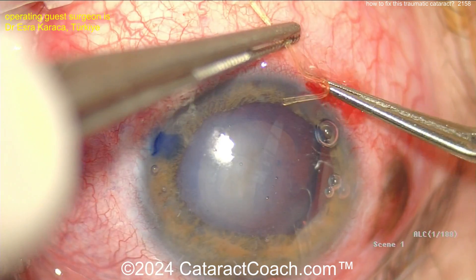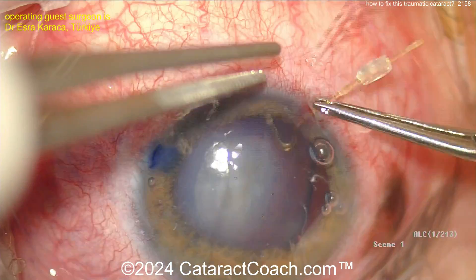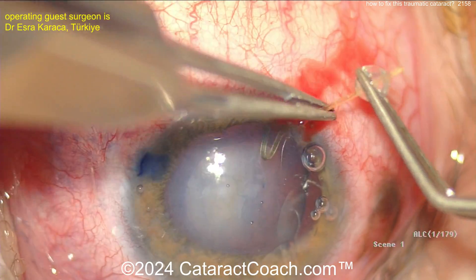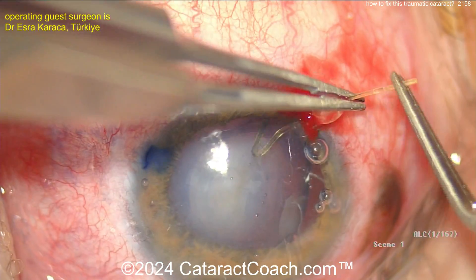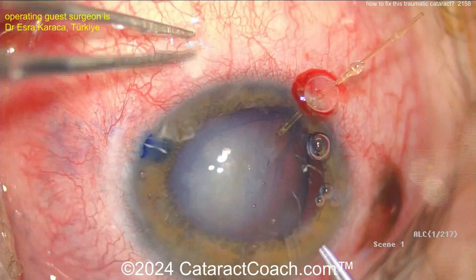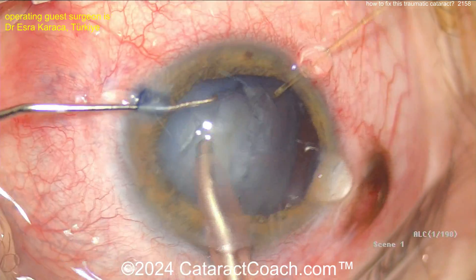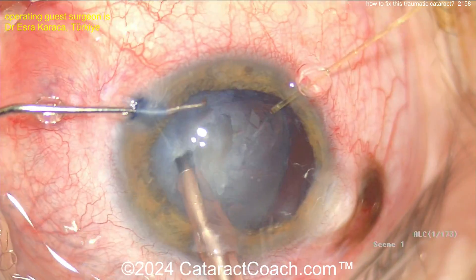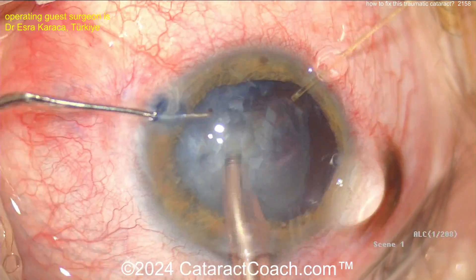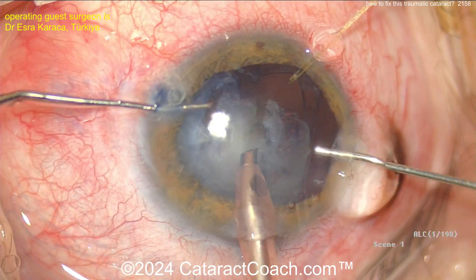A capsular support hook — this is different than an iris hook. This is actually a capsular hook, and it's a little bit longer and a little bit softer on that end with the curvature of the tip. This is going to give you great support here — kind of an artificial capsular support temporarily while you do the phaco. Put in two or maybe three of them, but you can get by with just one. I'd put a second one there to close that gap, because as you're operating you're breaking up the cataract into small little pieces and you don't want pieces to go through that gap into the vitreous cavity.